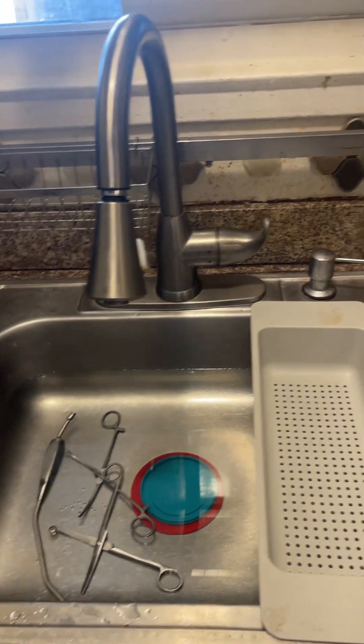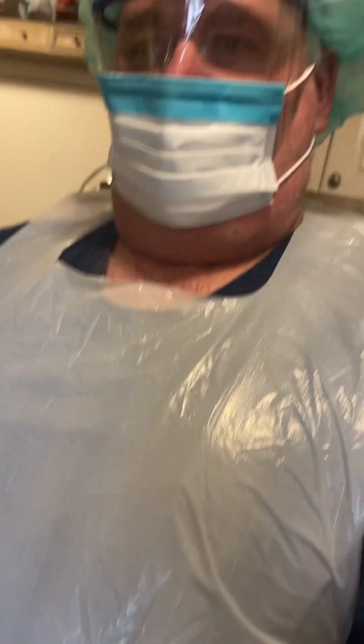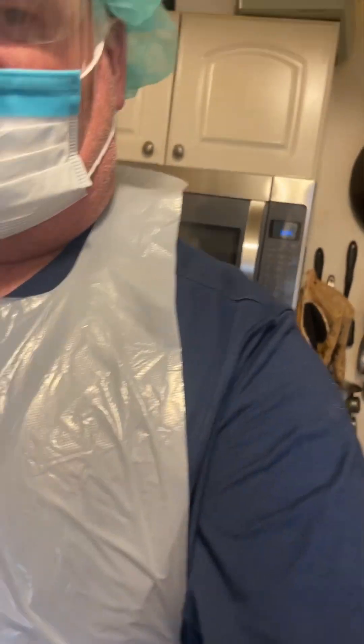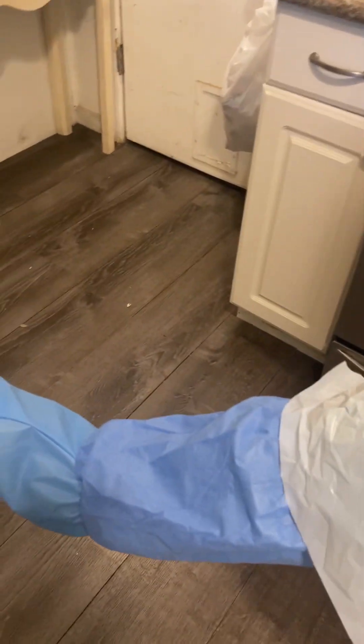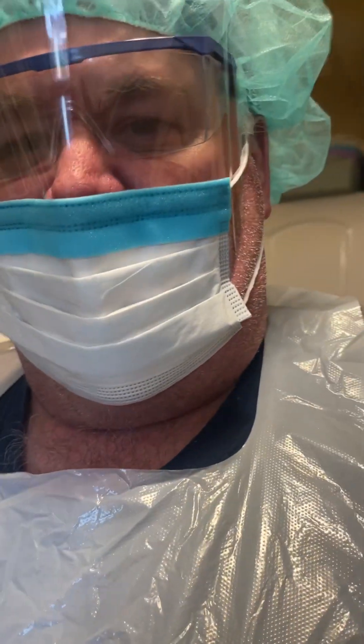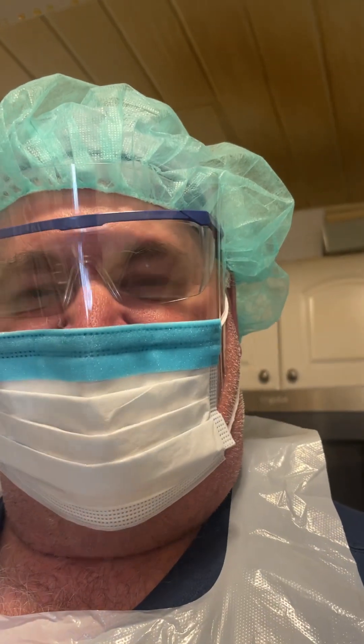Hello, my name is Keith McMenamin. I'm doing my decontamination video from my kitchen sink. As you can tell with my PPE, I'm wearing my head coverings, safety glasses, splash shield, and mask with an apron. Normally I would have long sleeves on but they were not provided. I also have shoe coverings and gloves that I will be putting on during the decontamination video.